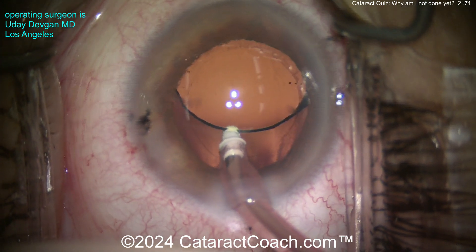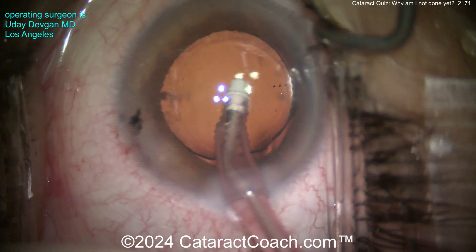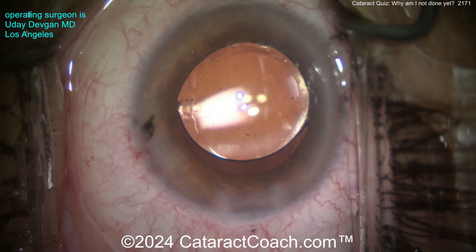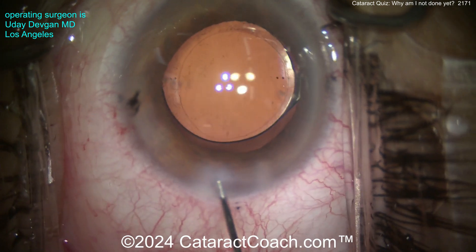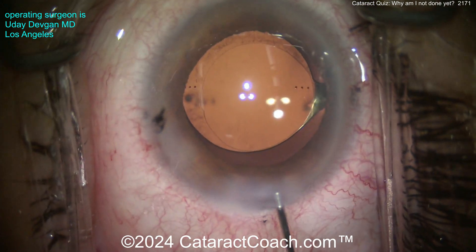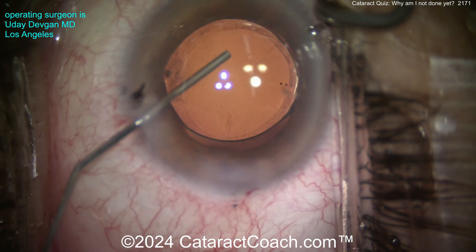This video runs at 25 or 30 frames per second on YouTube, and you can have a really good view — good enough to enjoy on your phone — but it's not sufficient to do really high-quality surgery. That's why heads-up display machines are always 4K video. Low-definition standard-def videos at 480p are complete nonsense.